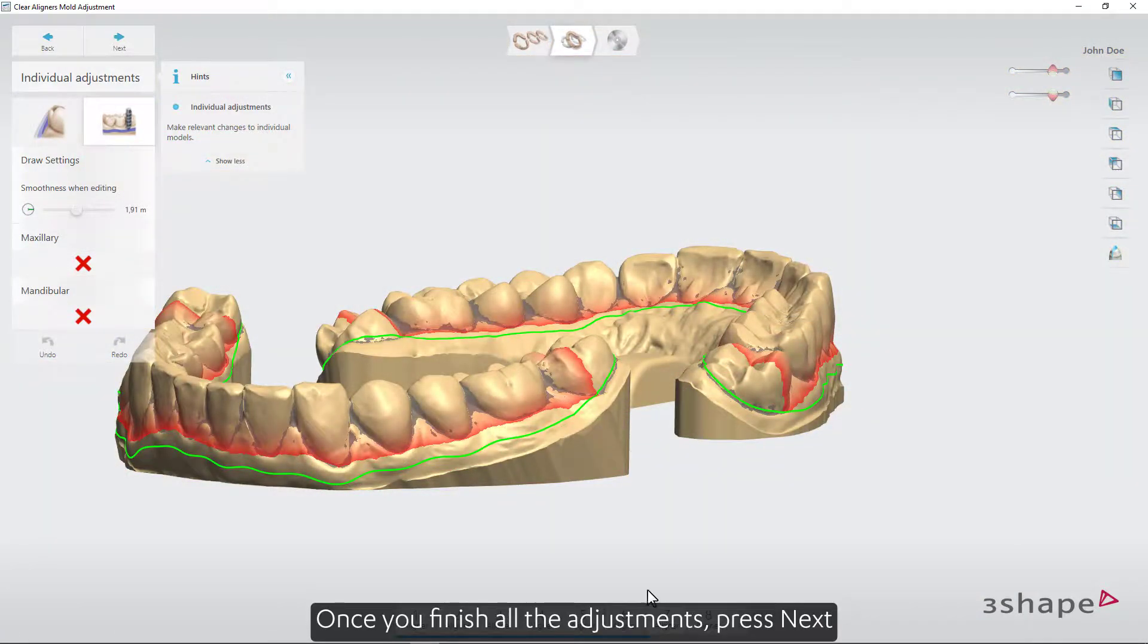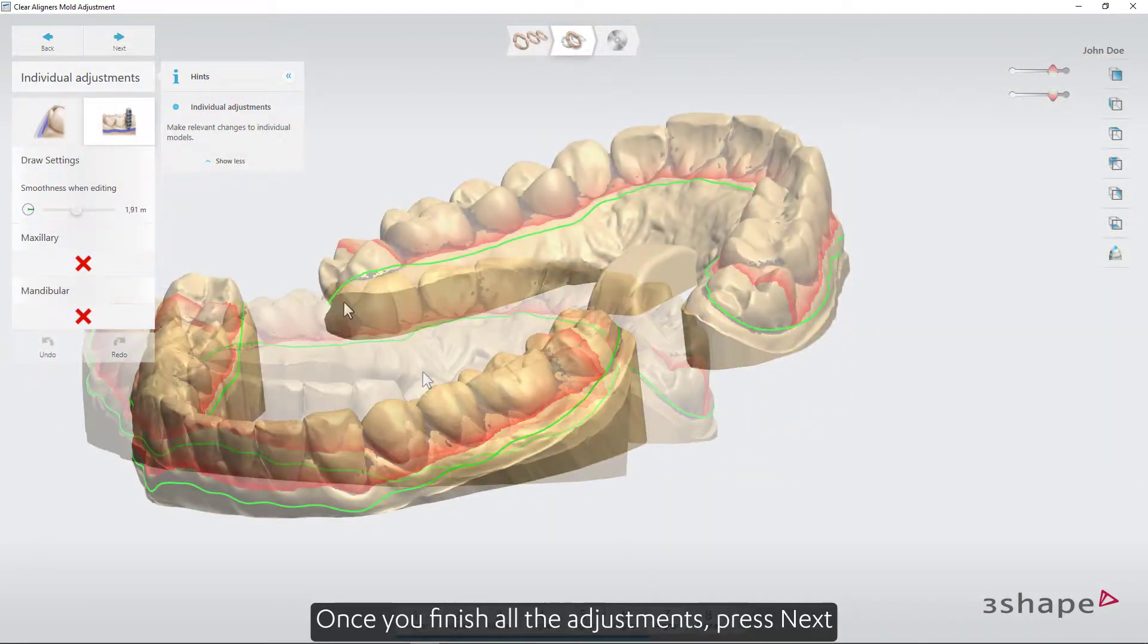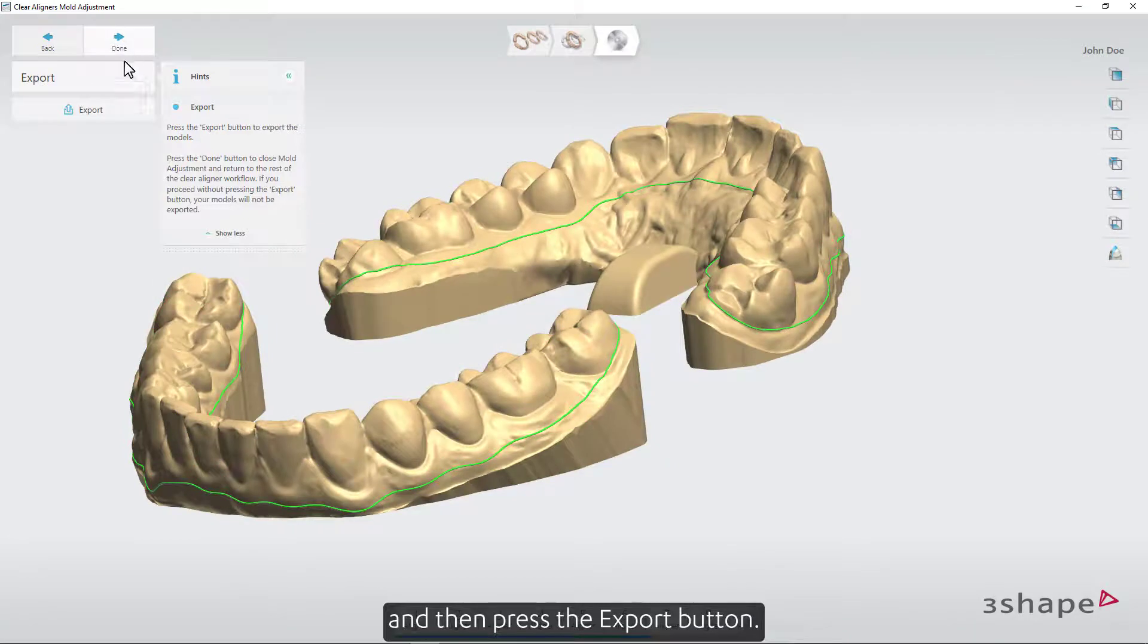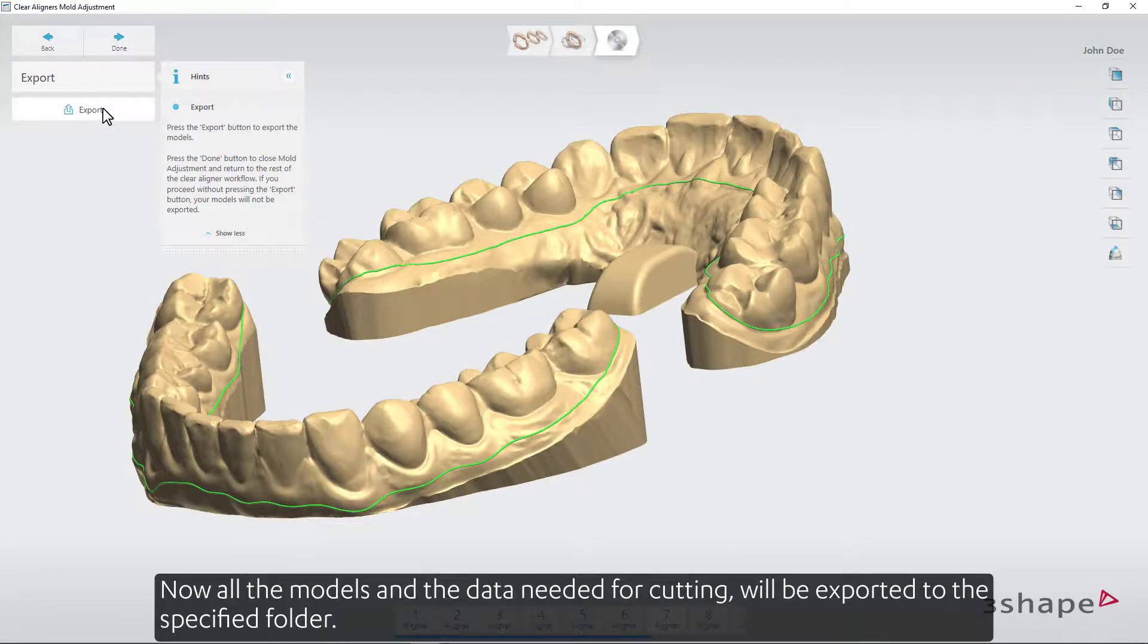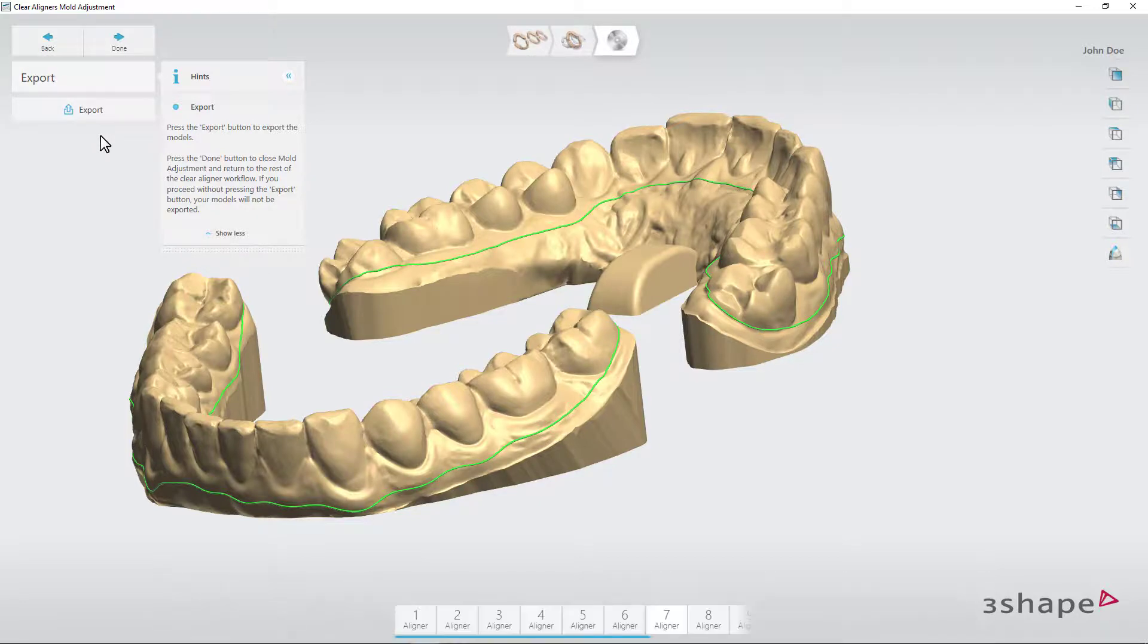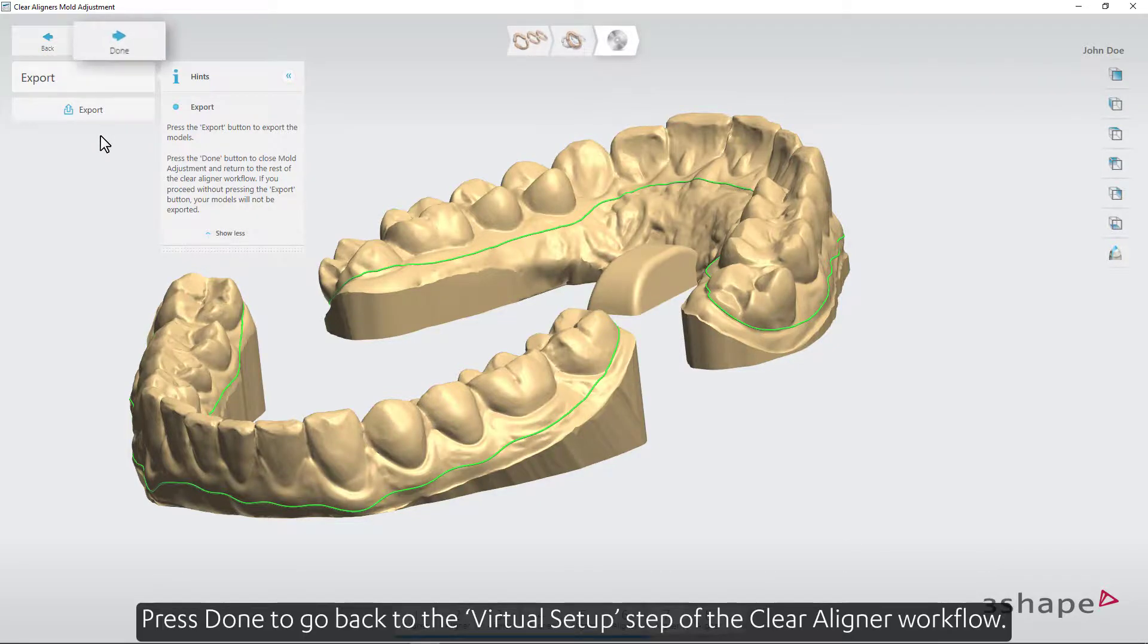Once you finish all the adjustments, press Next and then press the Export button. Now, all the models and the data needed for cutting will be exported to the specified folder. Press Done to go back to the Virtual Setup step of the Clear Aligner workflow.